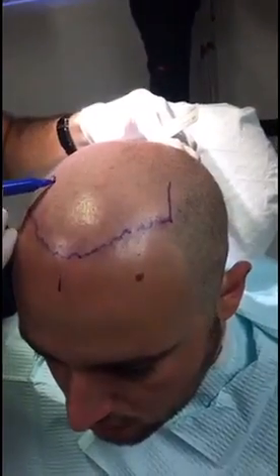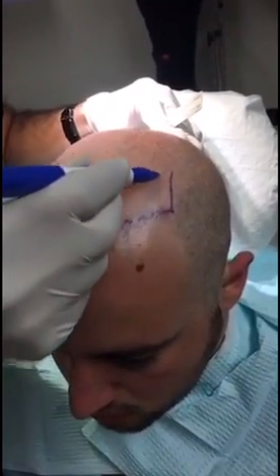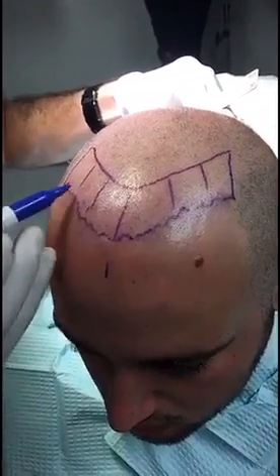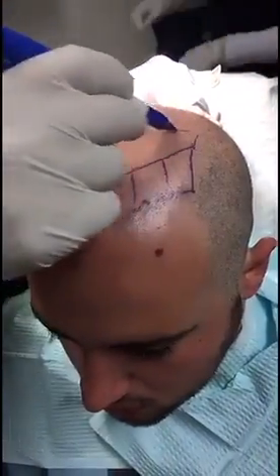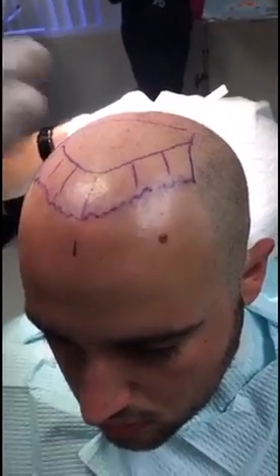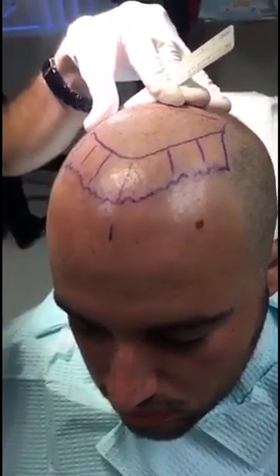Do 2000 grafts. I want to mark the area of maximum density in the very front and divide it into boxes so I know how many grafts I'm putting in each area. And then I go behind it and mark my secondary area. He's going to have a nice and solid hairline and he can comb it back and comb it to the side the way he wants, but he still needs more hair transplant in the back in the future.